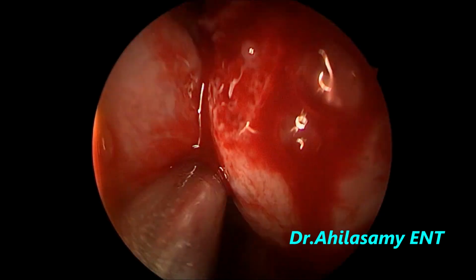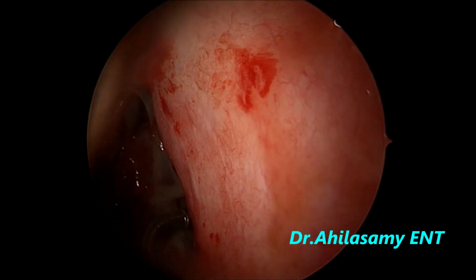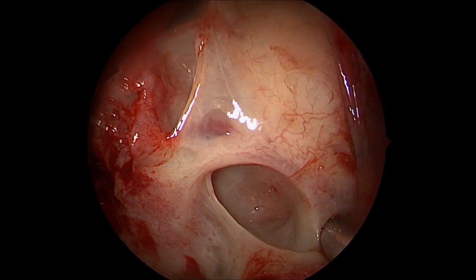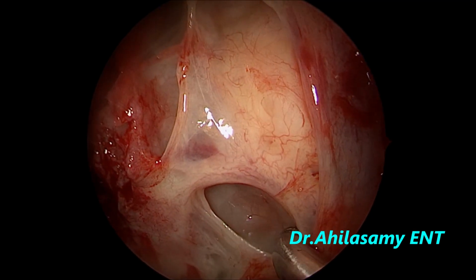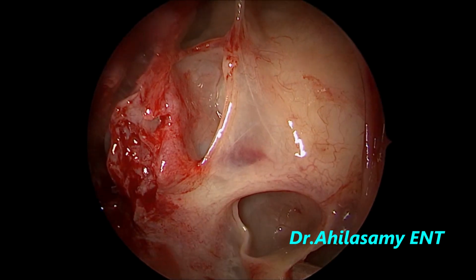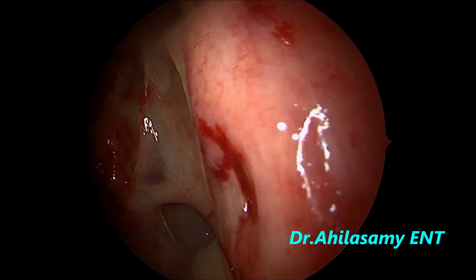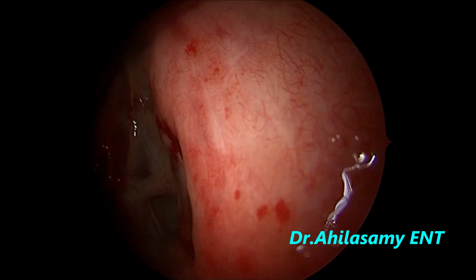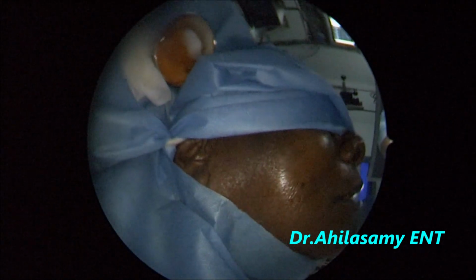Even though we didn't do a pre-op biopsy or an MRI scan, still by the appearance and everything, I thought it could be an inverted papilloma and did. The accessory ostia of the maxillary sinus, through which the pent-up secretions are being sucked out. There is no pathology within the maxillary sinus, so I didn't do any middle meatal antrostomy unnecessarily, which is not needed.